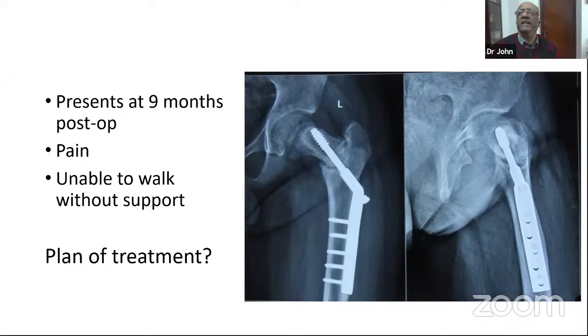Okay, so yes, I think that's fairly standard. Go across into the femoral head as well, actually. Across the growth plate. Is that as important? What implant would you use? I would be comfortable with a 140-degree valgus pediatric hip plate. Pediatric DHS? No, pediatric hip plate, 140, valgus plate. Okay, so the new plates. You would use the 4.5, 5.5 system in this? The 5 mm system. Yeah, 4.5, 5.5. The 3.5 would be too small for this, so 5 mm is appropriate for this age.